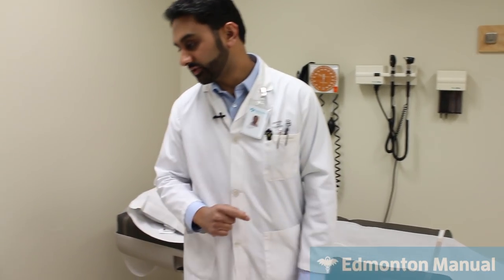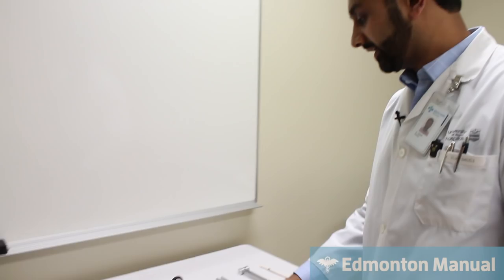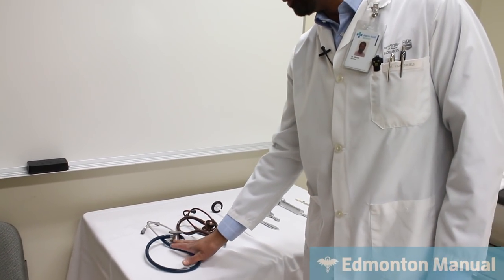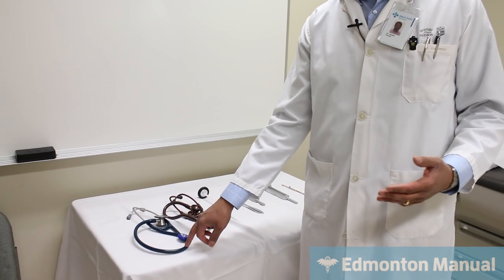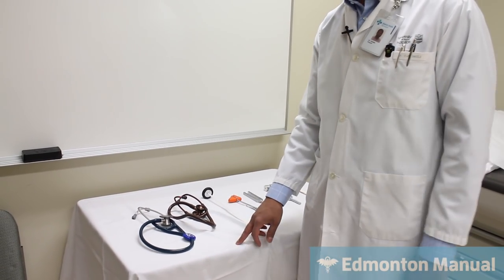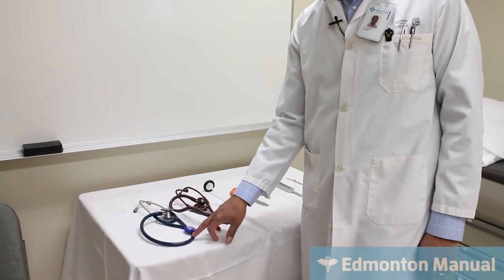But one of the things that we often don't remember to do is to wash the tools that we carry. So if we have a look at the tools over here, one of the key things you'll need to be careful about when you own your stethoscope is read the instructions very carefully as to what's appropriate material to clean your stethoscope. Okay, usually soap and water is totally fine for these stethoscopes. These ones, the kind of plastic they use, can generally stand up to the cavi wipes, sort of the stronger wipes that can wipe them down. But just be careful and read the instructions very carefully.